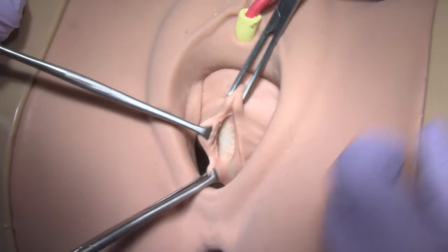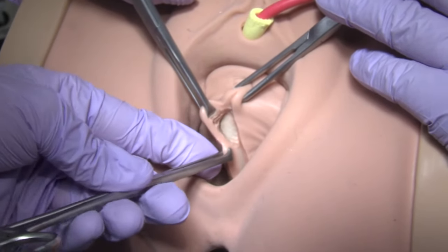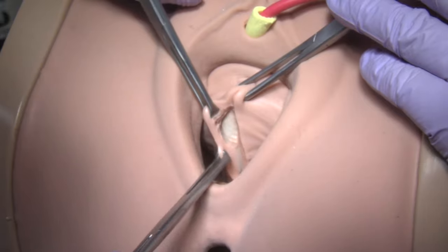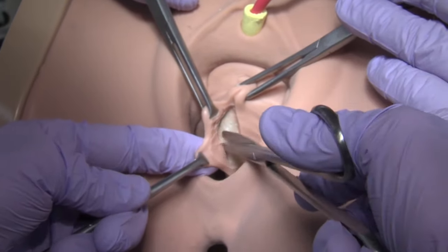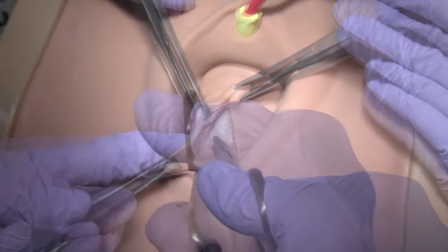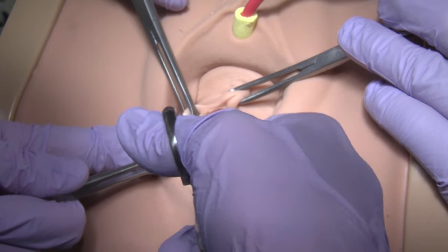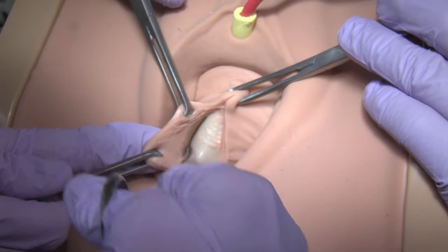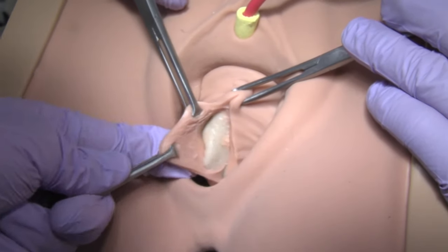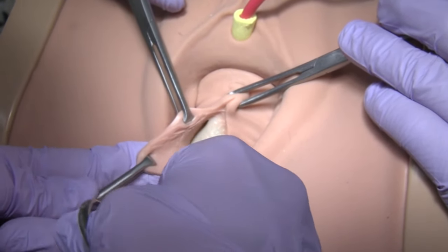Surgical tips: Place an Alice clamp on the epithelial edge. Using your forefinger as traction, use Metzenbaum scissors to carefully dissect the fibromuscular layer away. An assistant can maintain traction medially on the underlying muscularis tissue layer with atraumatic pickups. Providing traction and counter-traction is very important for a clean dissection.